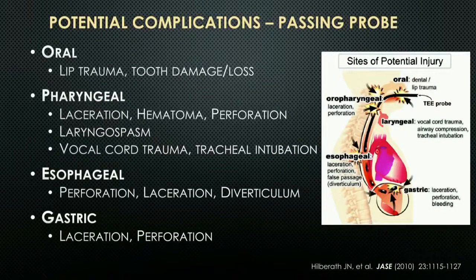So, having the indication doesn't necessarily mean that we could just ignore the potential ramifications of the procedure. And there are many potential complications of passing a blind probe into the esophagus. And these are fair game on the exam. There will be questions. So just beware that there is the potential for oral trauma, both of the lips and the teeth.